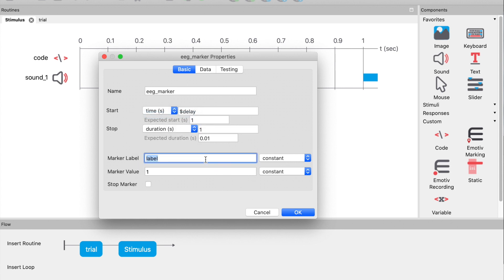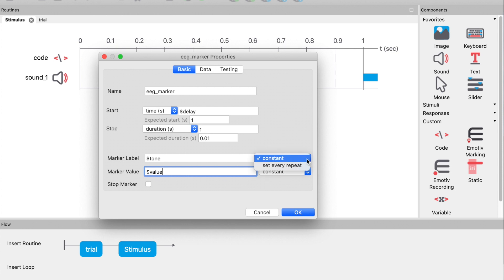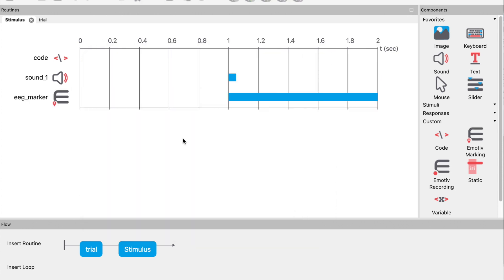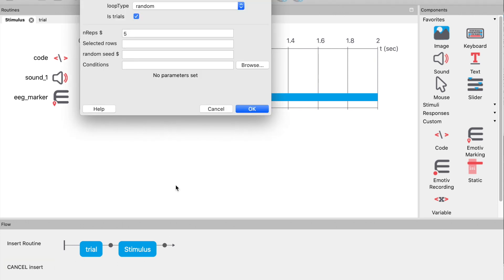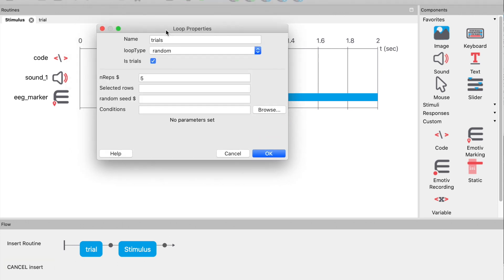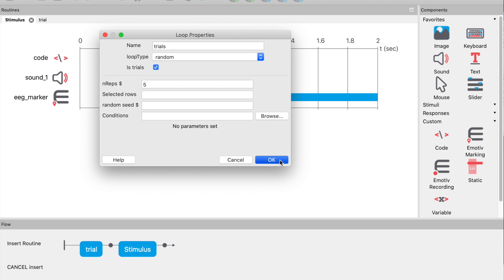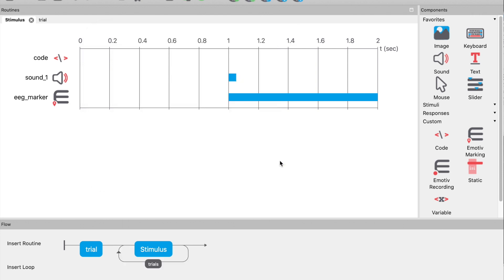Set the label to $tone and the value to $value. Now add a loop around our stimulus routine. And now we are ready to test.